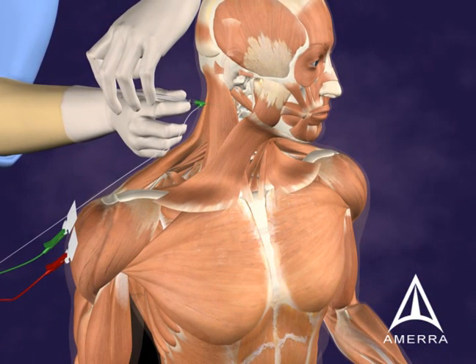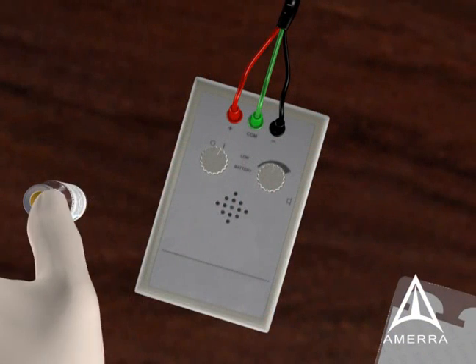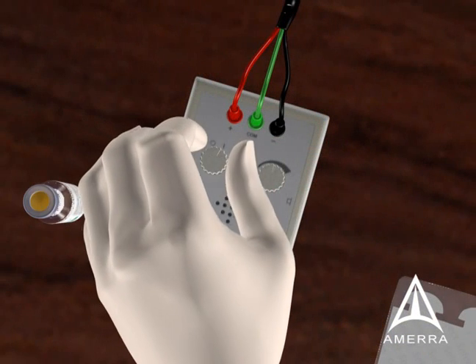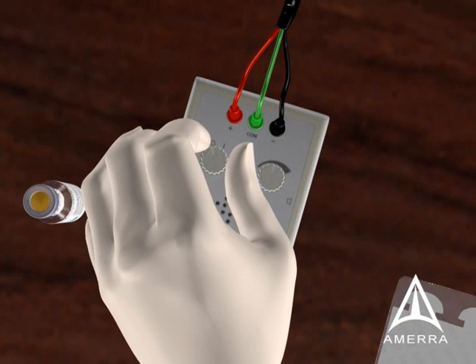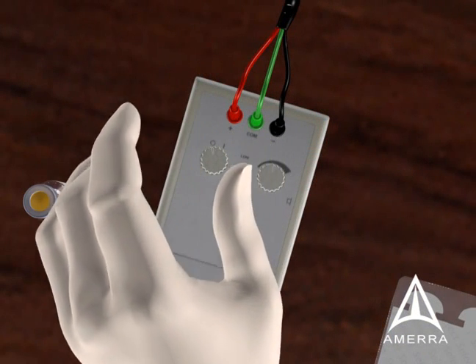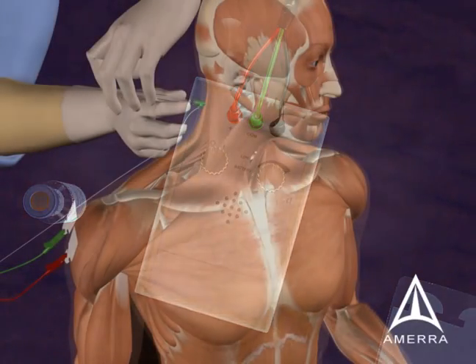Thereafter, the injection is completed, and the EMG amplifier is turned off, and the chemodenervation needle is removed from the patient.